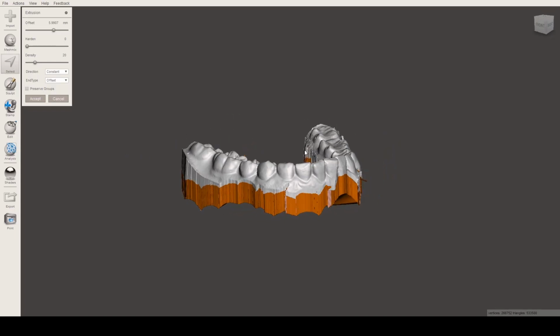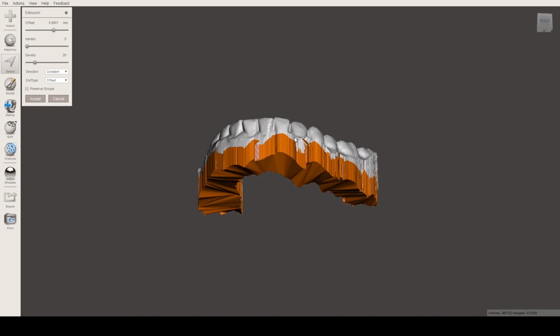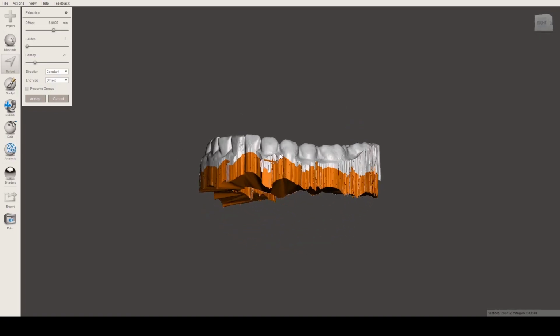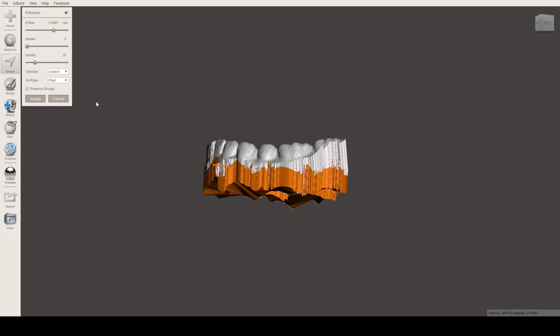We want to add up, for example, in real life scenarios, we're gonna have these points where you really want to add to it, because when you're printing 3D models, you're just gonna file this thing and flatten it out with sandpaper, or I don't know, a knife if you can. So let's just accept that.